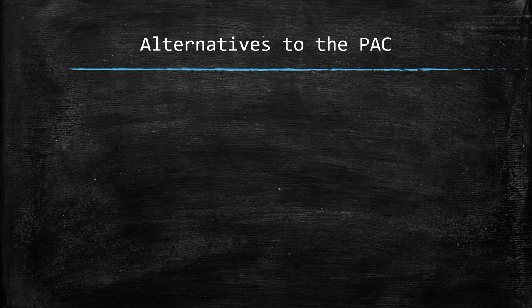I think it's fair to say that the pulmonary artery catheter did not live up to its early promise. The measured pulmonary capillary wedge pressure and cardiac output are too inaccurate to be relied upon, which means that calculated values like systemic vascular resistance are inaccurate as well. Nevertheless, if we had more accurate data, the assumption is that we could make better clinical decisions for our patients.